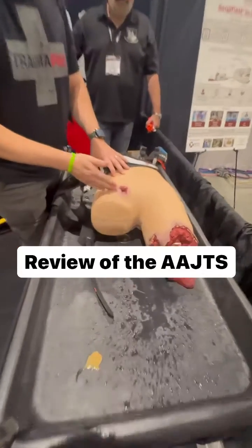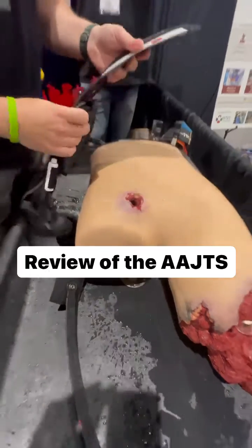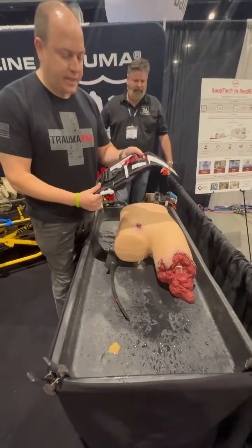So we have an uncontrolled pelvic bleed here. We could try traditional wound packing, but I want to really highlight the thickness and the use of the AAJTS.